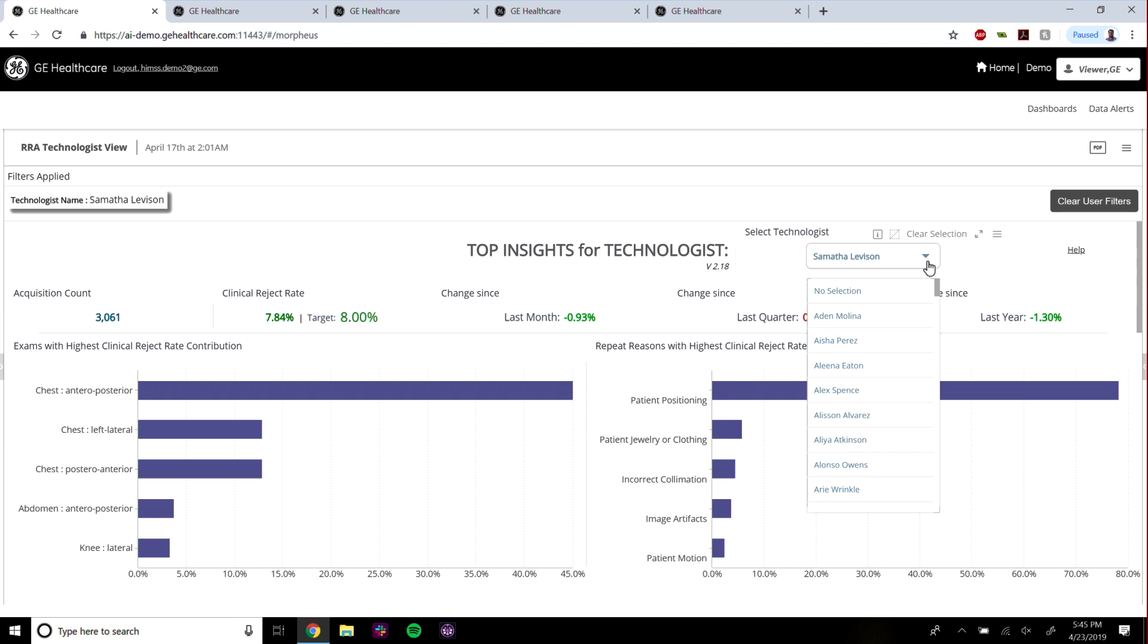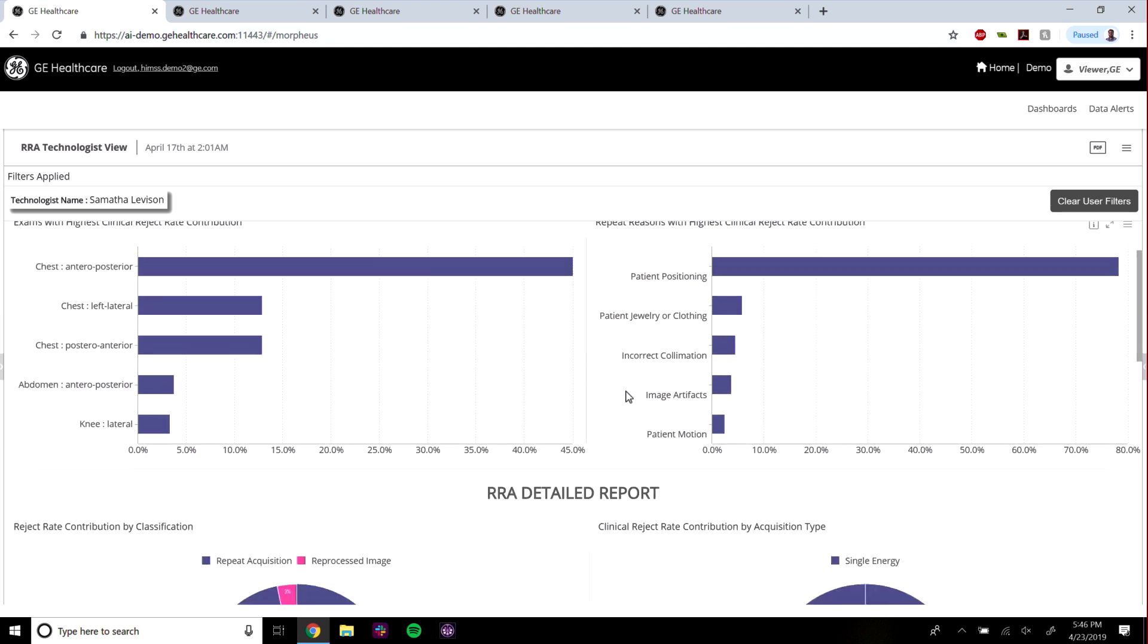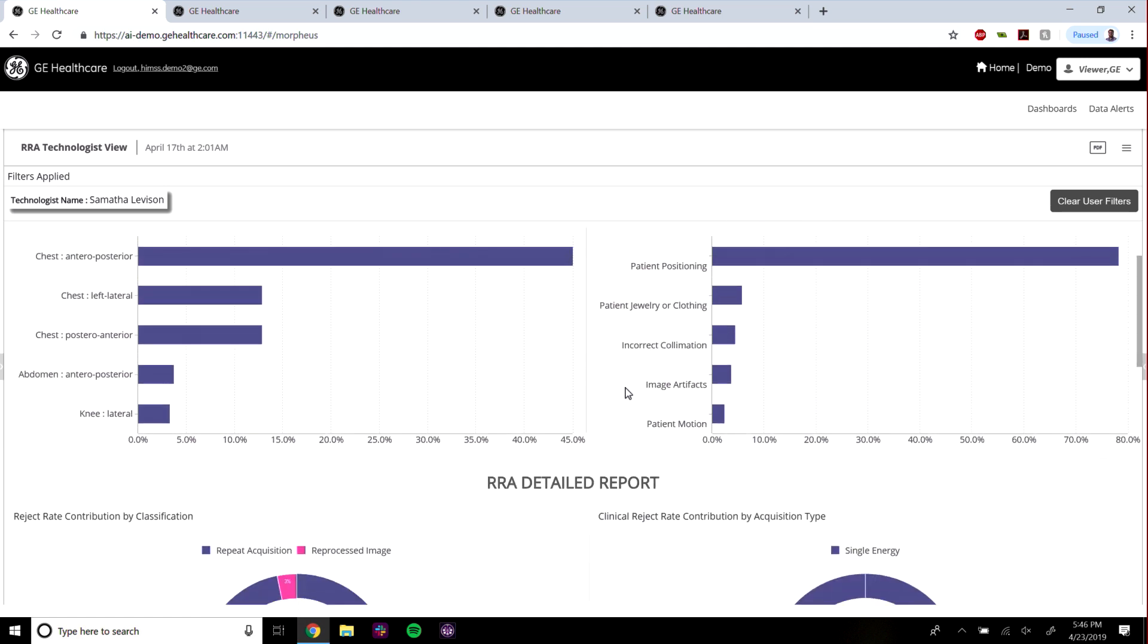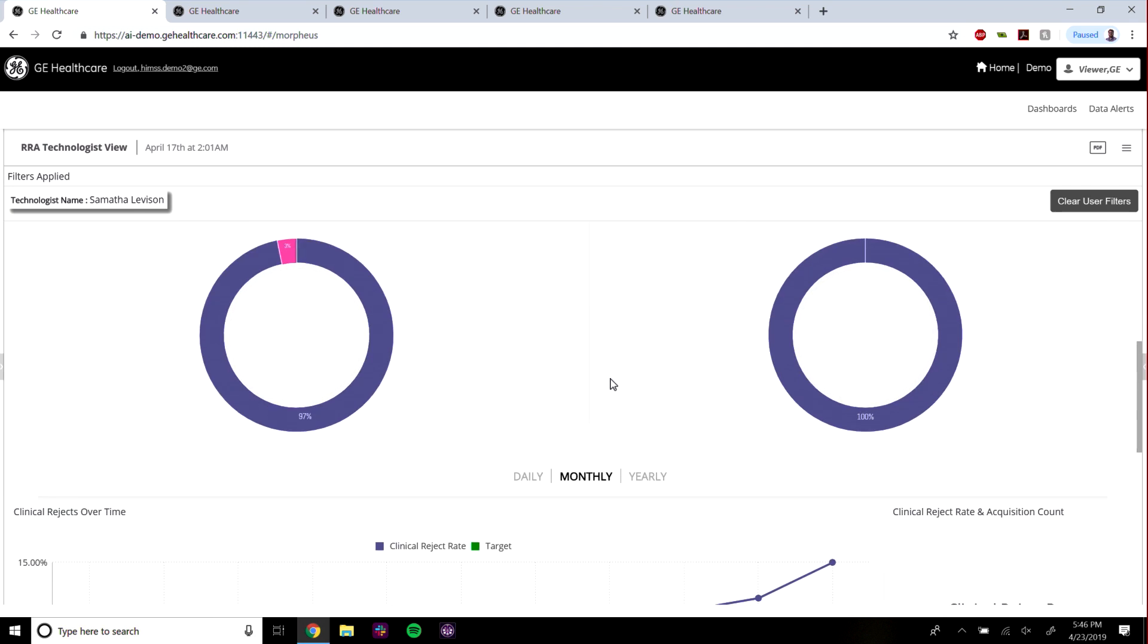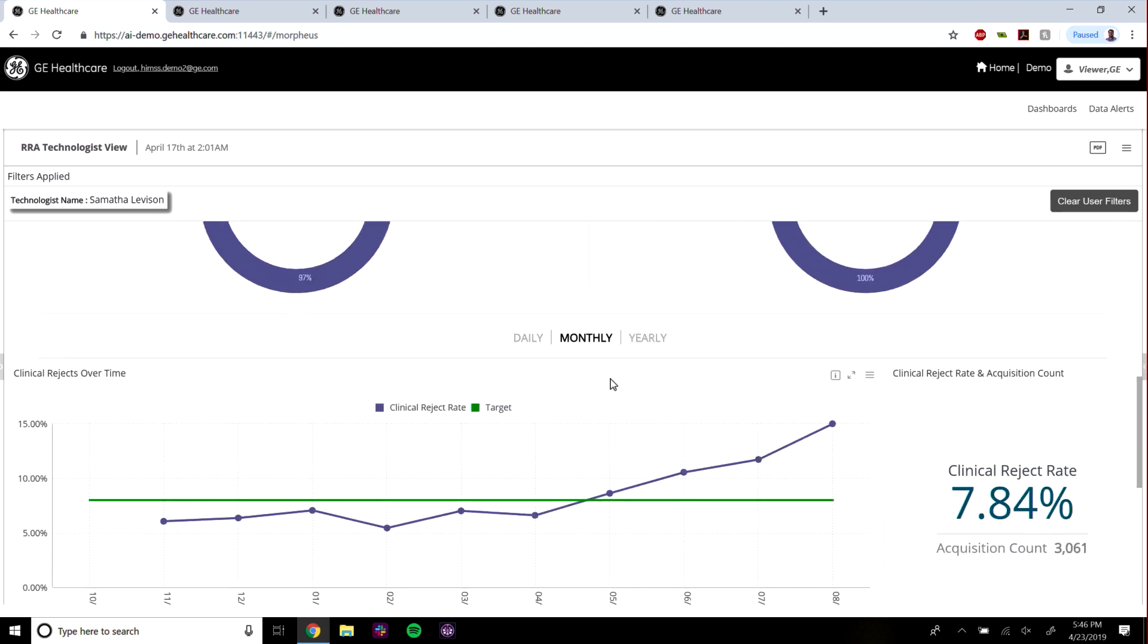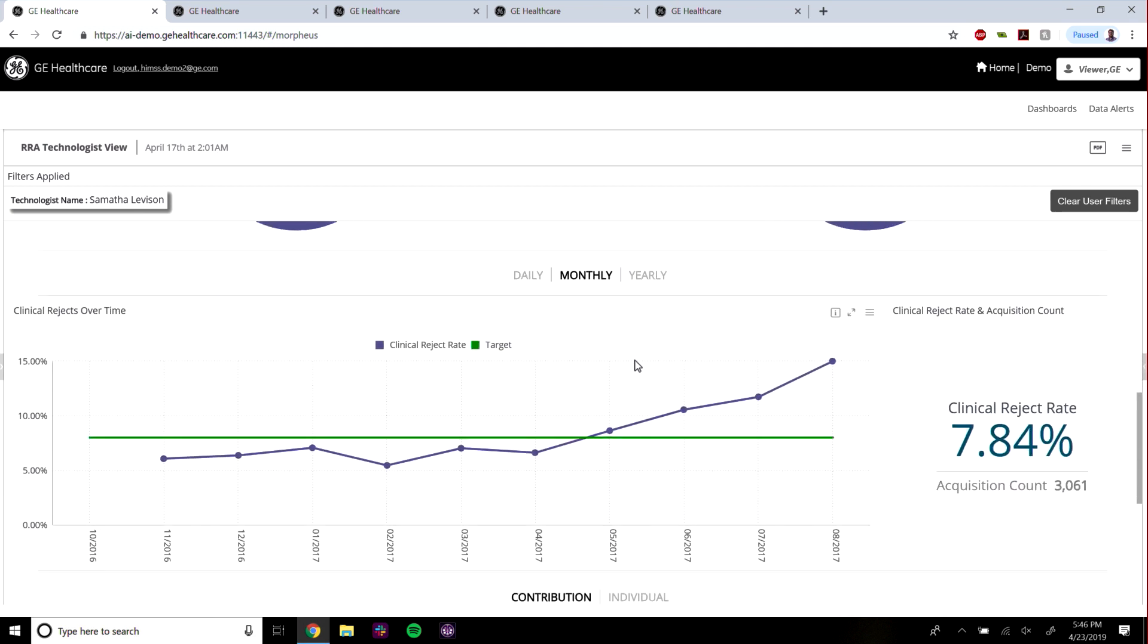Here you can select an individual technologist's name and evaluate their performance on what exams they're struggling with, what type of reject rates they have.